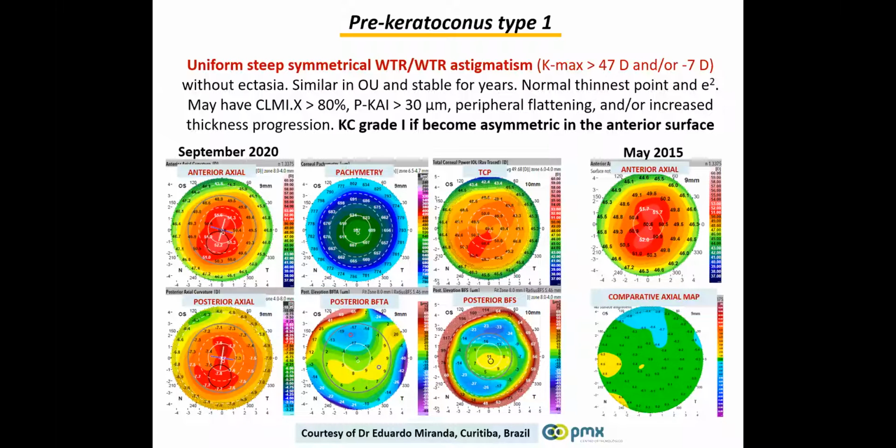I know some people in Quito, Ecuador, did surgery, PRK or PRK with cross-linking, in this kind of cornea, especially to reduce the high astigmatism these corneas used to have. I have one cornea with 2 symmetric rings, because there was a lot of anisometropy between both eyes.